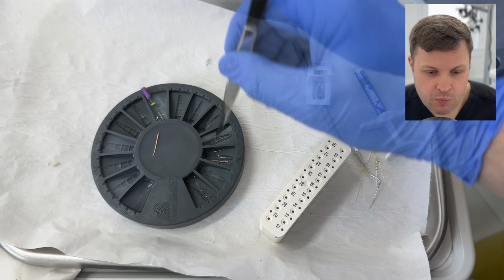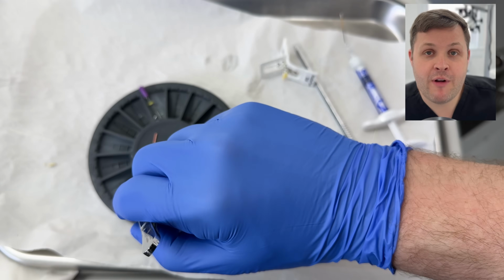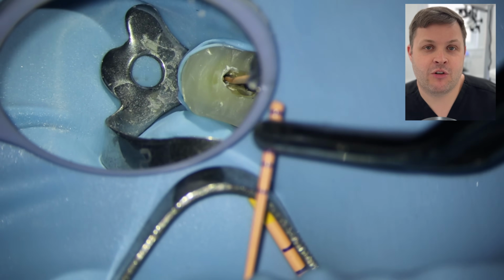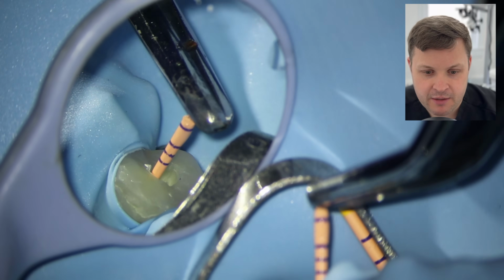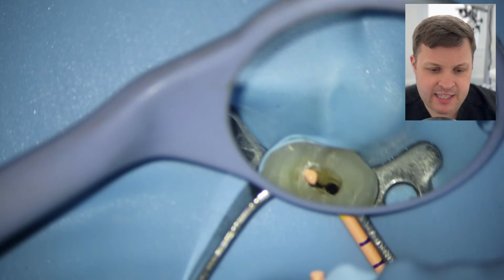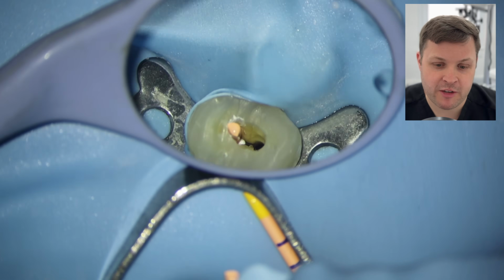I'm going to put that to one side, and then quickly prepare the correct GP cone by dipping it in isopropyl alcohol, giving it a bit of a dry, and then I'm going to place this in the correct canal. And then very, very gently, I'm going to push this GP cone to length, and we can see now that this is reaching the correct mark where it has been snipped off.